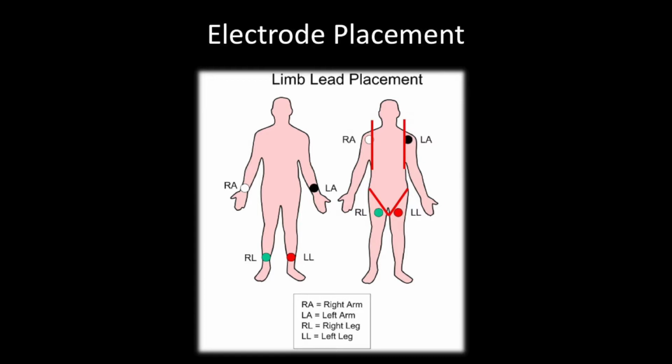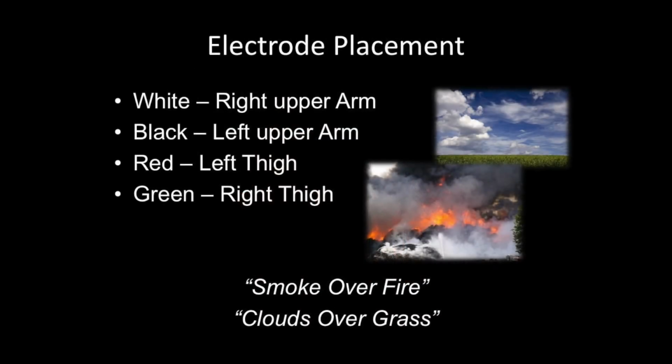Will you see it done differently? Yes, you will, by the manufacturer, by the calibration, all of that. This is how we're going to do it. Okay? How do I place them? Right arm, left arm, right leg, left leg, they're labeled, just like the abbreviations on the ends of the cables. You can also use this. You can use either these acronyms down here, or you can memorize this, or whatever you want to do. It doesn't matter to me how, just do it right.